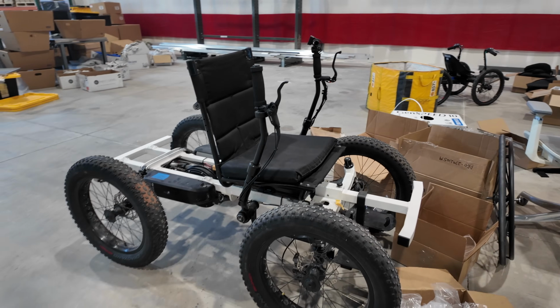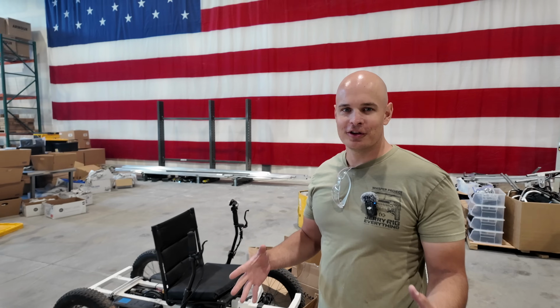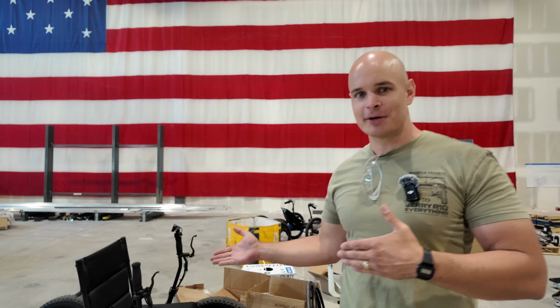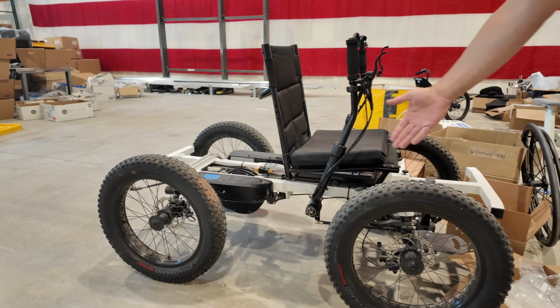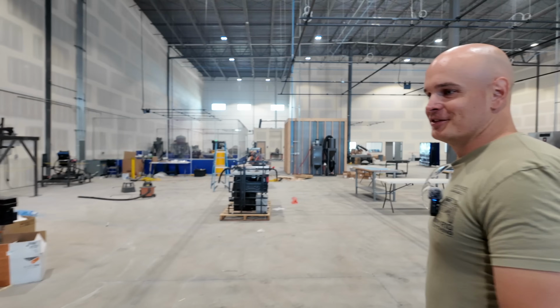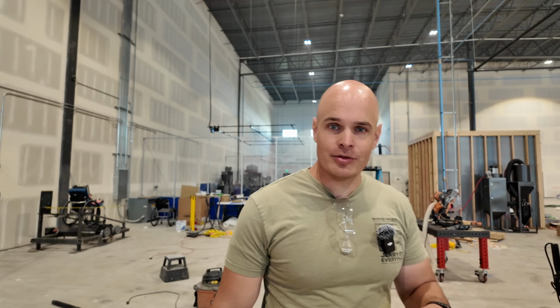Five years ago, I had the idea to make off-road wheelchairs, and that's kind of how Not a Wheelchair started. We just assembled a bunch of bike parts together and made a contraption out of bike parts that was more accessible. So these handles can drop down and someone can transfer into it from a wheelchair. And this goes, with 2 batteries, about 35 or 40 miles, with a top speed of about 13 miles an hour. Sorry about the noise, again, active work zone. But we have a 4-wheel drive version of that off-road wheelchair coming out probably next month, and that thing is a beast. It can tow 300 pounds for probably 20 miles.